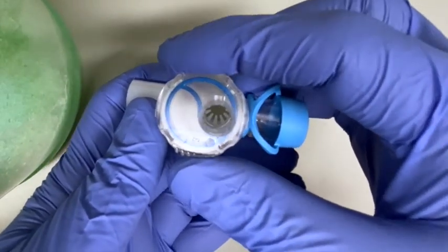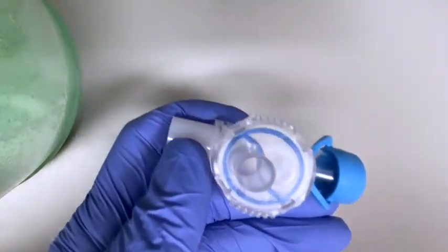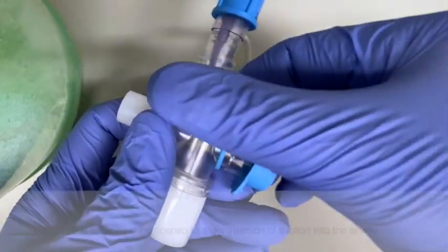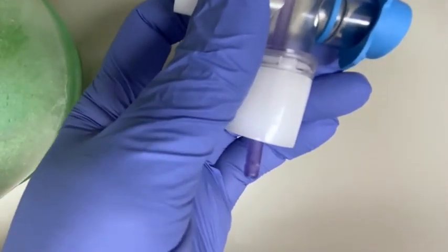In the open position, suction — or in this case the bronchoscope — can be passed into the tracheostomy tube. Here you can see how the system locks in place for suction. In the closed position, suction tubing is unable to pass through, but in the open position the suction tubing is able to pass.